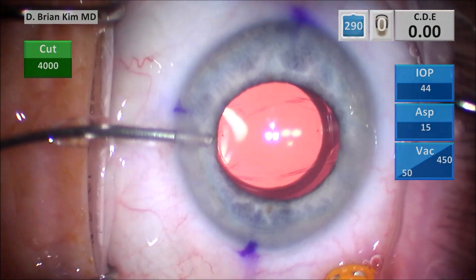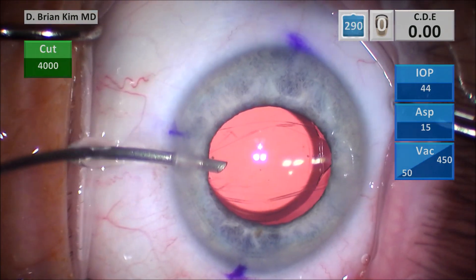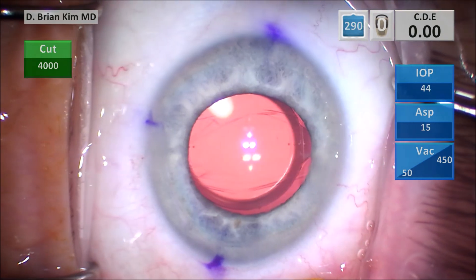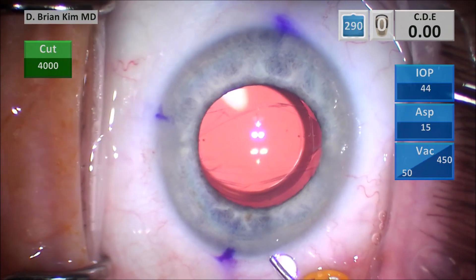I come out with the vitrector, then come out with the anterior chamber infusion cannula. I hydrate my incisions, then take the trocar cannula out and massage the eye — resulting in a really nice self-sealed sclerotomy as well as sealed incisions.